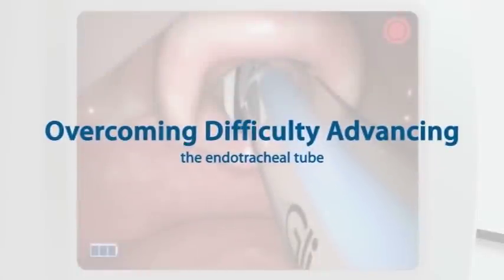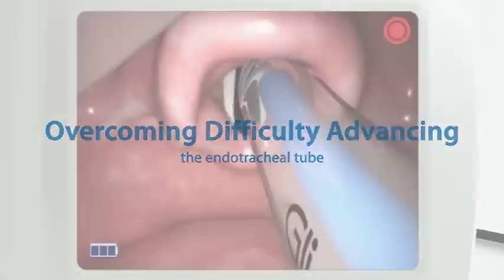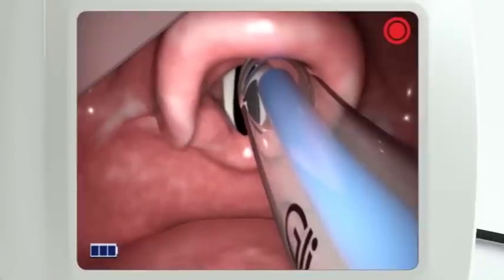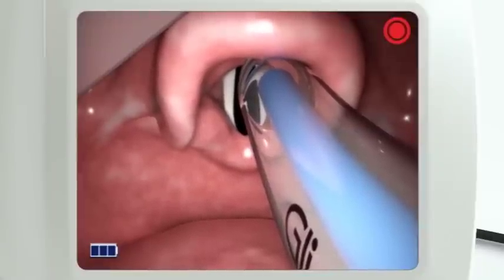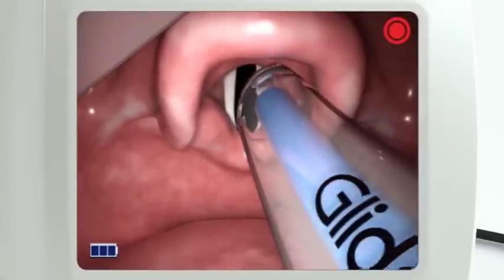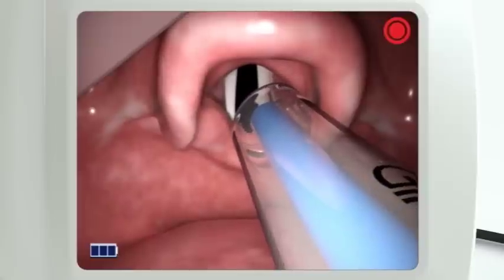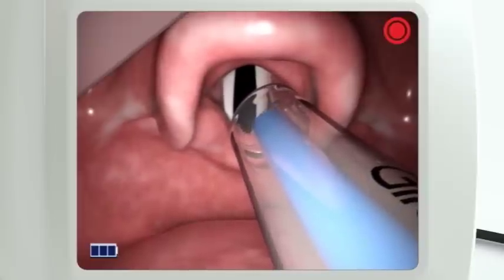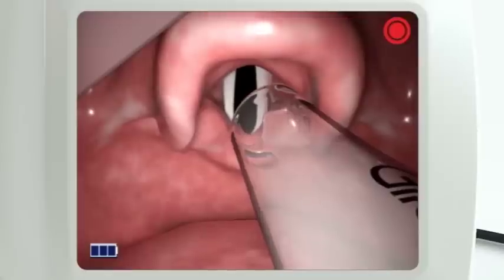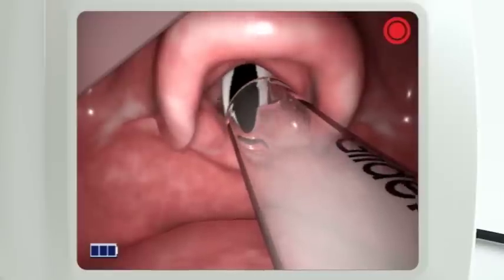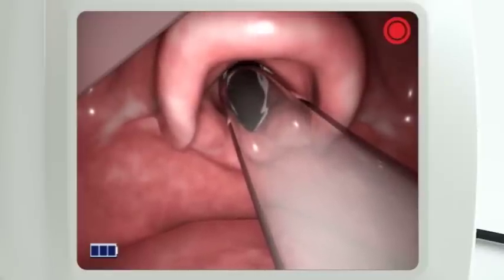If you are having difficulties advancing the endotracheal tube because it's getting hooked up anteriorly at the glottic opening, try turning the endotracheal tube slightly to the right. Then carefully remove the stylet and advance the tube again, ensuring that you're holding the tube in place as you're removing the stylet.